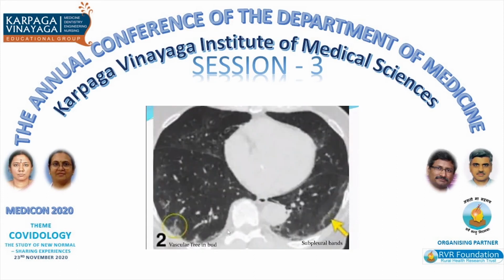What you see in these patients is a vascular tree in bud. This is a vessel, and this vessel is thrombosed, and that is why it is prominent, because of which there are certain areas which are seen here.